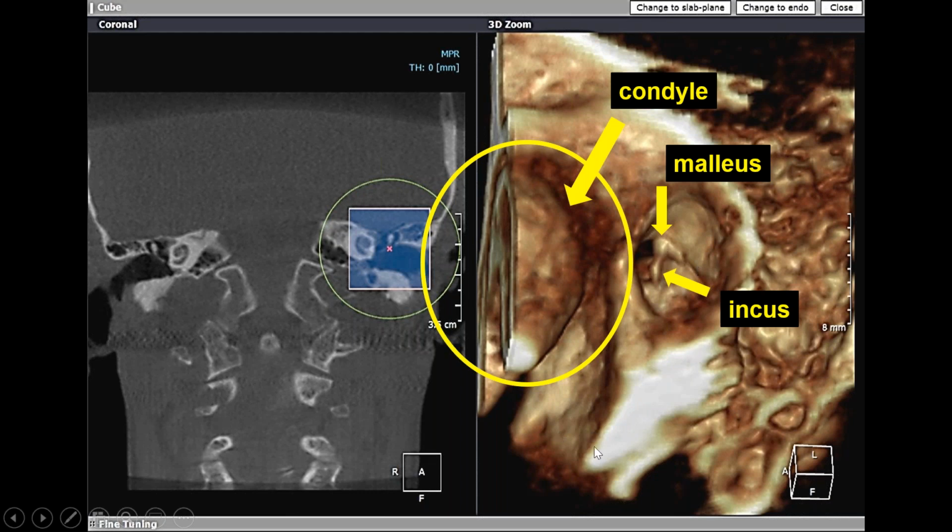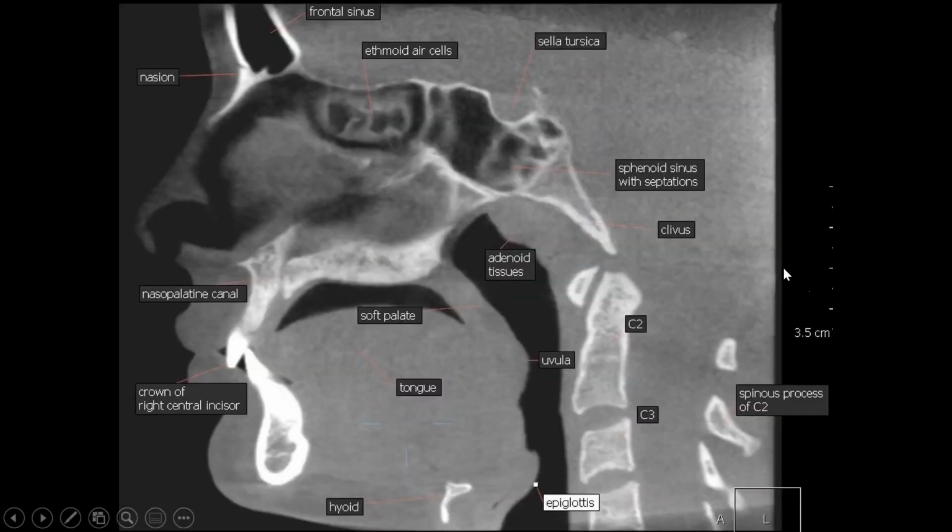And we can see them in 3D color. These I won't disclose, we'll just go over it. When the orthodontists measure SNA, SNB, well, there's nasion right there, that little kind of sharp angle. And this is the nasal bone. It's actually two flat bones paired in the midline.